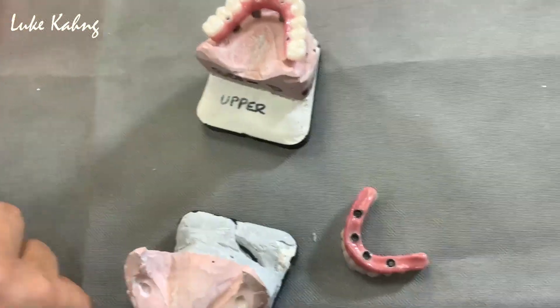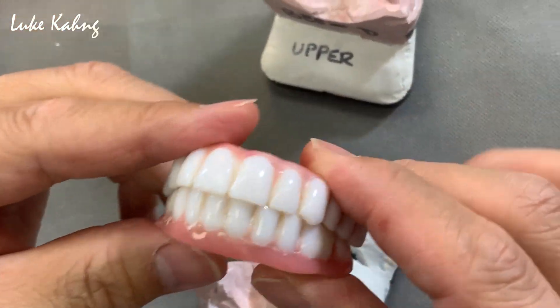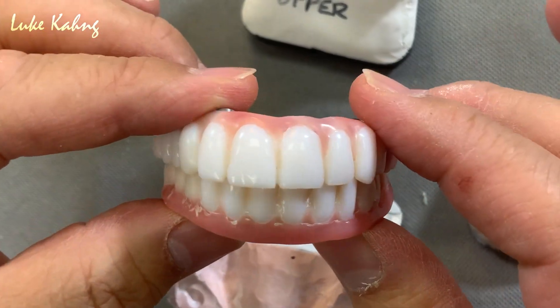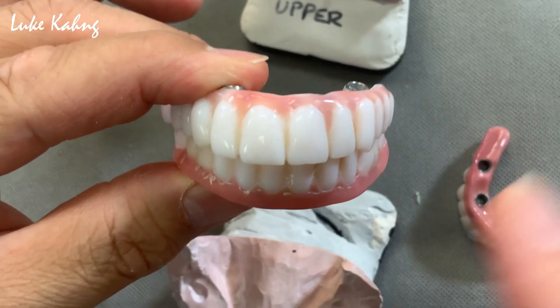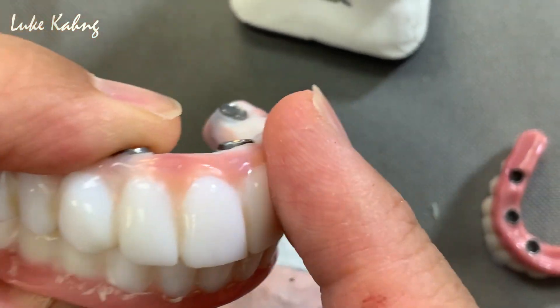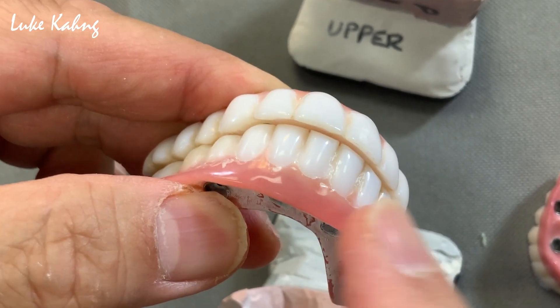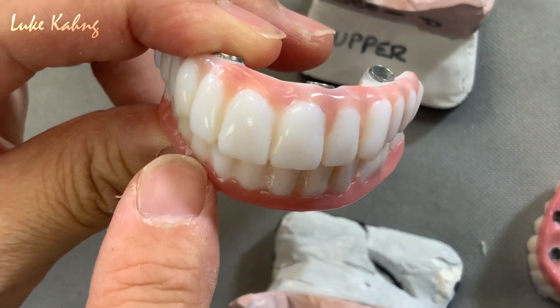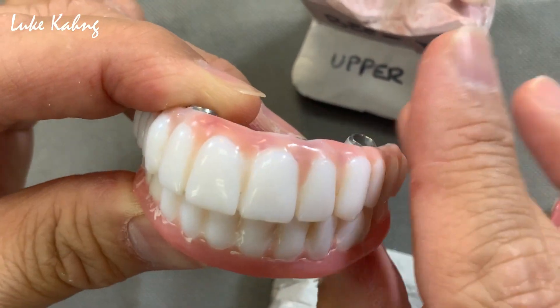From the PMMA — this is the PMMA design — we're trying to follow the shape and contour, especially the emergence profile. The occlusion contact is slightly open, but we have to add a little bit. And here it's slightly long, so we have to cut it. We're trying to make a good cosmetic design.